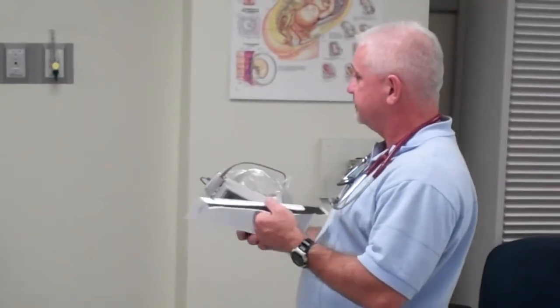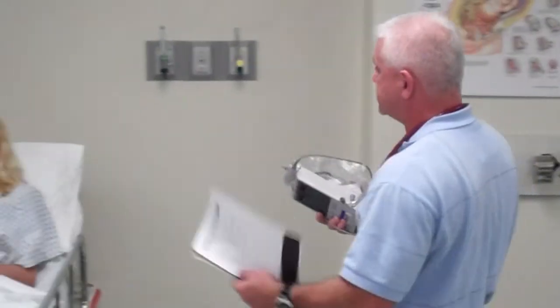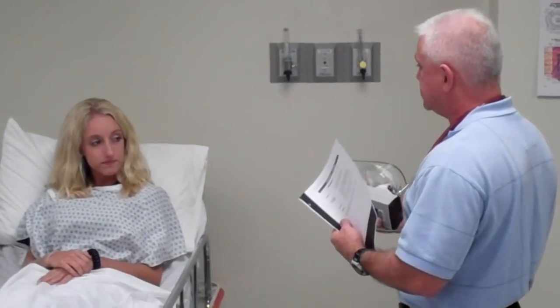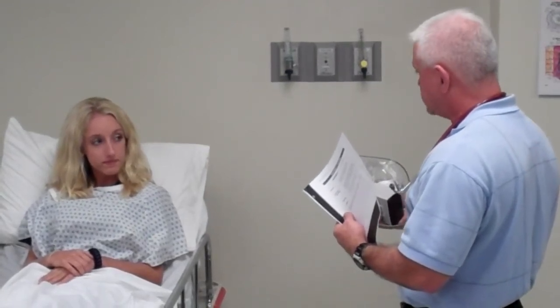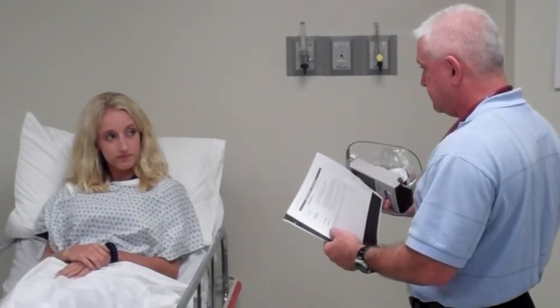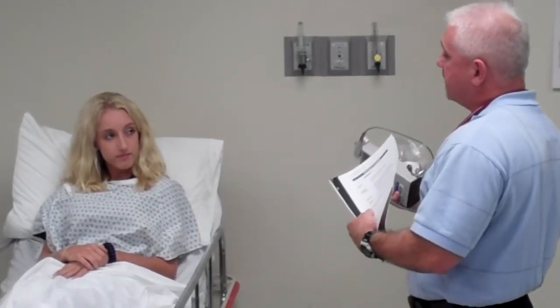Hi, Miss Katie. Hello. Hi, my name's Alan. I'm from Respiratory Care. I'm here to put some oxygen on you. Your physician felt it might help you feel less short of breath. How are you feeling right now? Not good? Okay. Let me just go ahead.